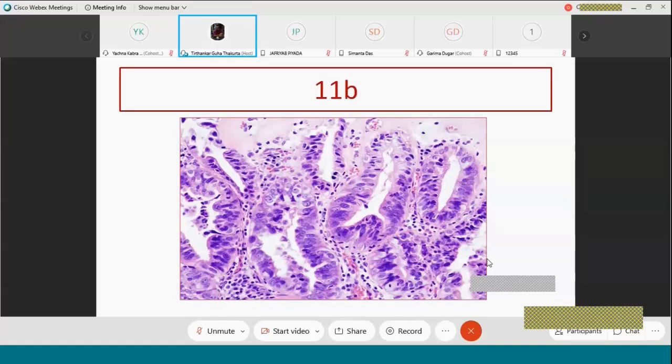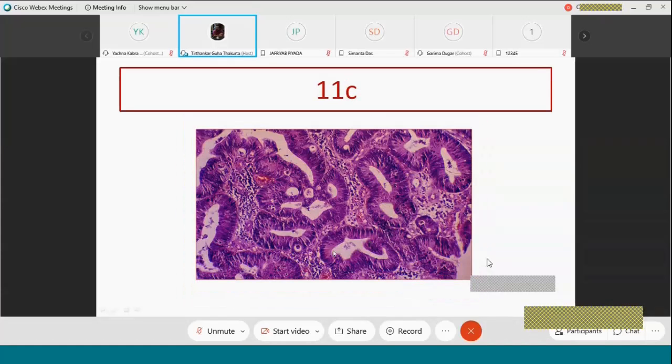This is another picture you see of adenocarcinoma. You can easily see the nuclei are so big. So there is a high nucleocytoplasmic ratio and the glands are all irregular. And they are lined by multiple layers of cells. So this is an adenocarcinoma again. This is another picture of adenocarcinoma. Cancer will typically look very violent. It looks as if the cells have become enraged with large nucleus, dark blue stain and irregular arrangement. That is typically how a cancer appears.